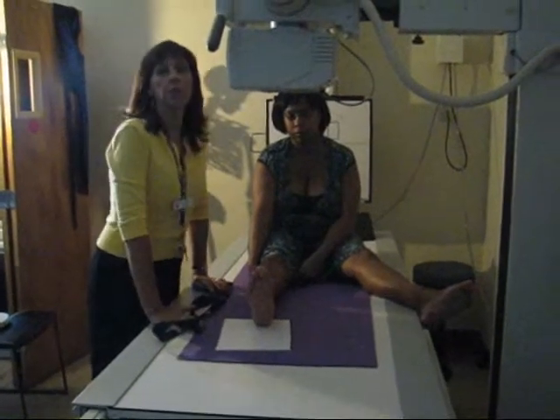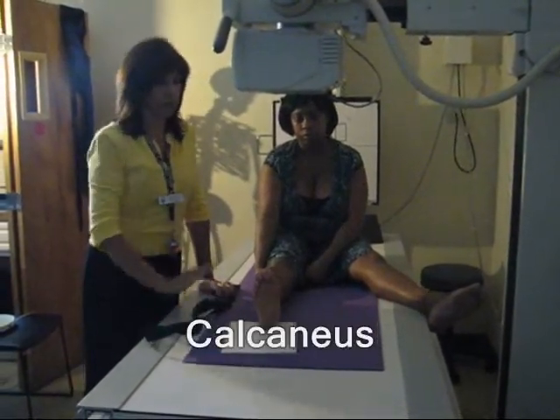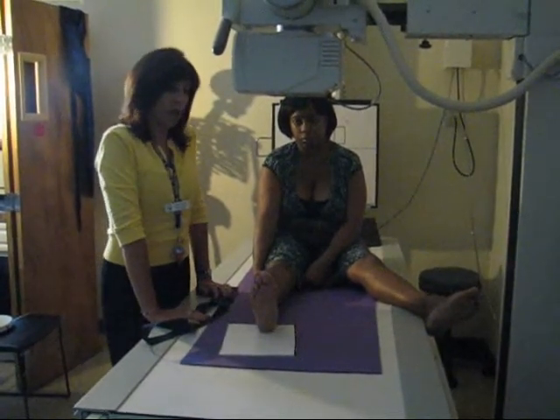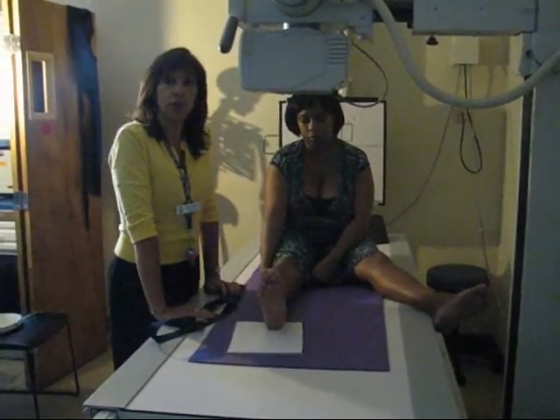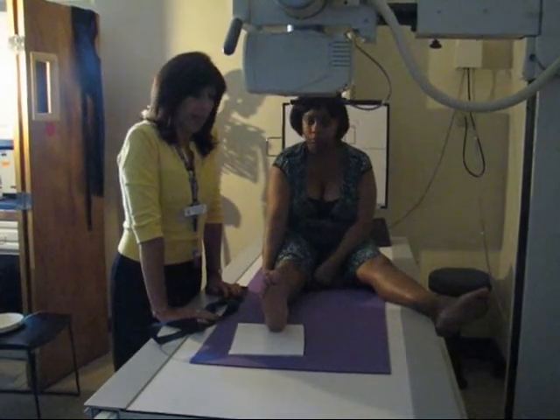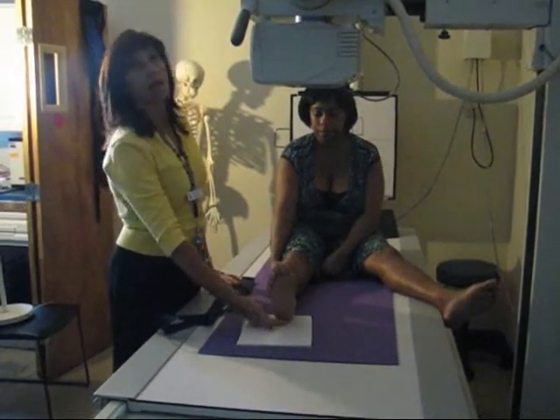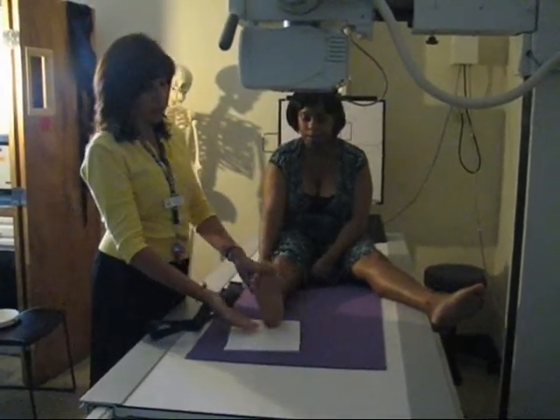We are now going to proceed with the examination of the calcaneus, or the heel. For the calcaneus routine examination, we have two views: axial or plantar-dorsal, and lateral. As you know, the calcaneus is your heel bone.